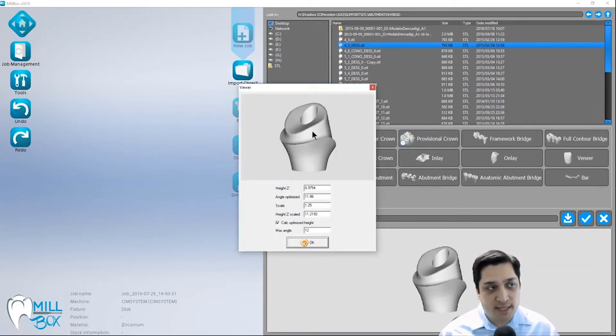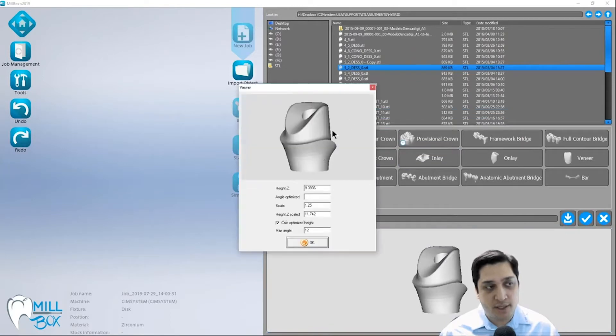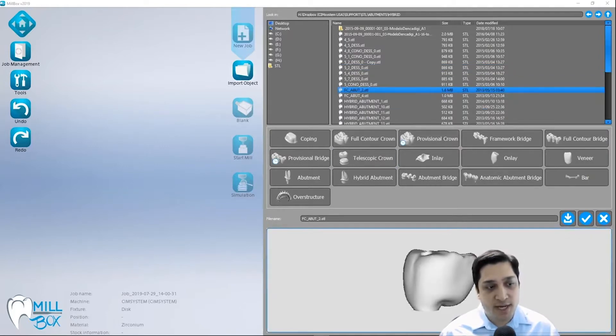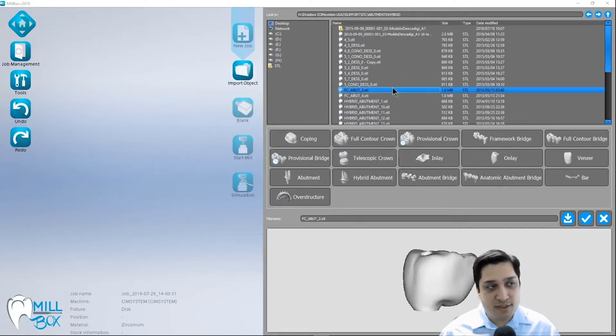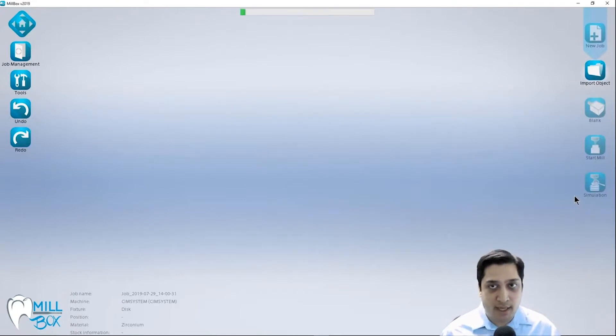Screw retained or hybrid cases I consider as having titanium bases that are going to be cemented internal to these. These are typically not going to be hexed or trilobe engaging interfaces and they're typically going to be designed with the geometry of a ball nose tool kept in mind. This could be a hybrid abutment or a screw retained crown where the abutment and crown are not separate but are instead one full piece. We're going to select these as a hybrid abutment during the import process - not abutment or anatomic abutment - because these are not hexed or trilobe engaging interfaces.